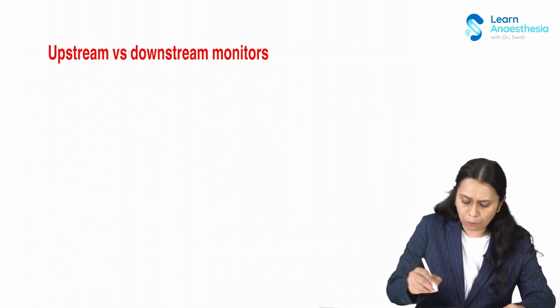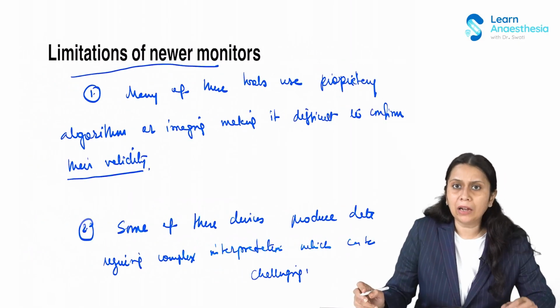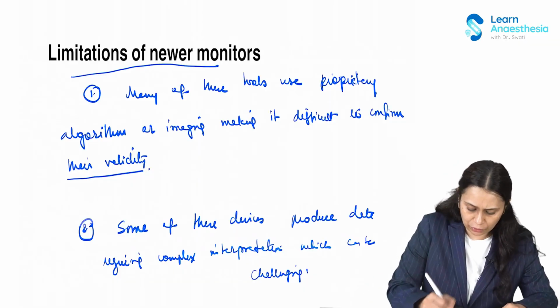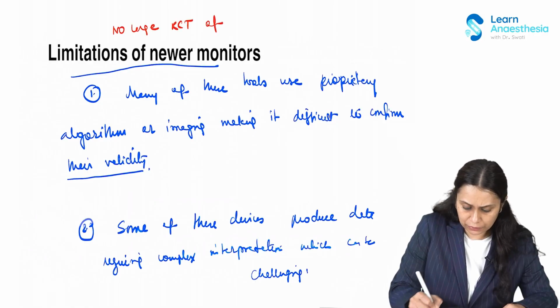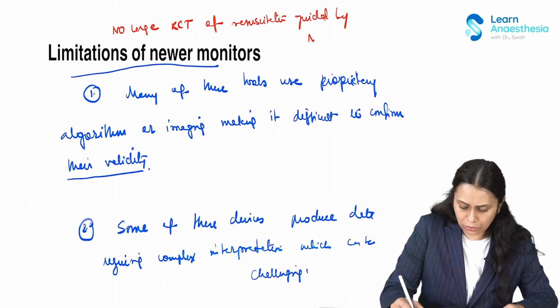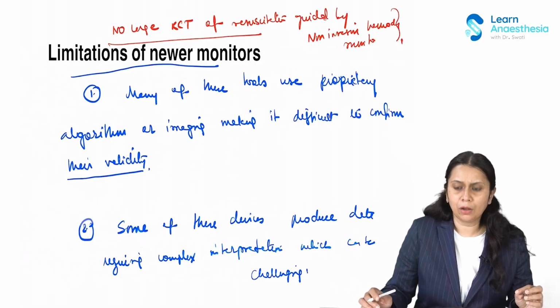Now, apart from this, the most important limitation of these newer monitors was the lack of large RCT trials. There was no large RCT of resuscitation guided by non-invasive hemodynamic monitors, which we are going to discuss, right? So there was no large RCT which proved their benefit.